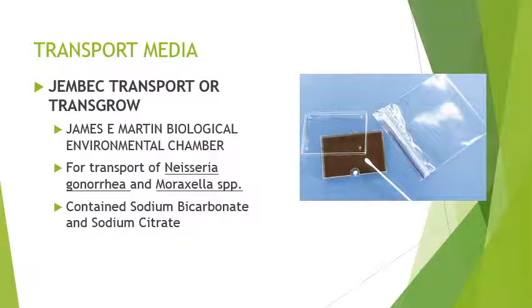Next would be your Jembec transport or Transgrow. This is known as the James E. Martin Biological Environmental Chamber. This is for the transport of Neisseria gonorrhoeae and Moraxella. It contains sodium bicarbonate and sodium citrate.